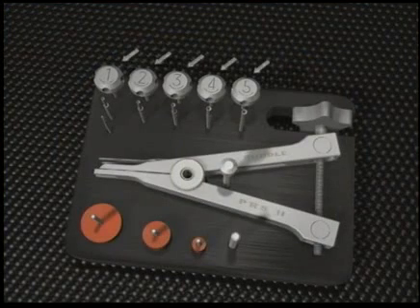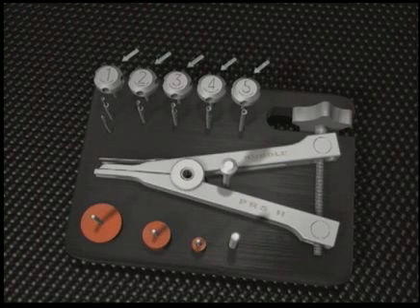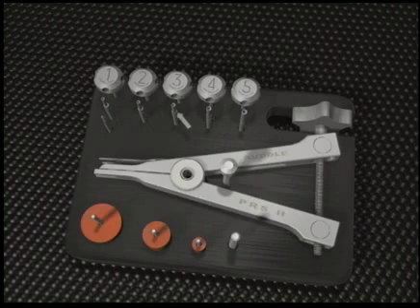There are 5 tubular taps whose internal diameters range from 0.6 to 1.6 millimeters. Each tap is precisely paired to correspondingly numbered trephines. As an example, using a number 3 trephine dictates the selection of a number 3 tap.